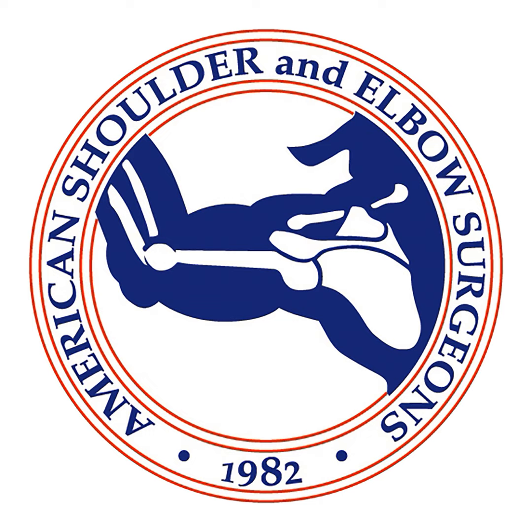There are times where it's a normal tendon length, but if I'm worried about the tension on the repair, I'll just do a good single row repair and then still put the thin patch over the top. The times where I'm adding a dermal allograft patch, something with more structural property, is for the type 2 failures like Peter mentioned. And if it's someone that's had 3-4 failed cuff repairs and they still have some tissue, but it looks thin and atrophic, then I'll add dermal allograft over the top to try and get something thicker and a little more structural. Did that answer your question?